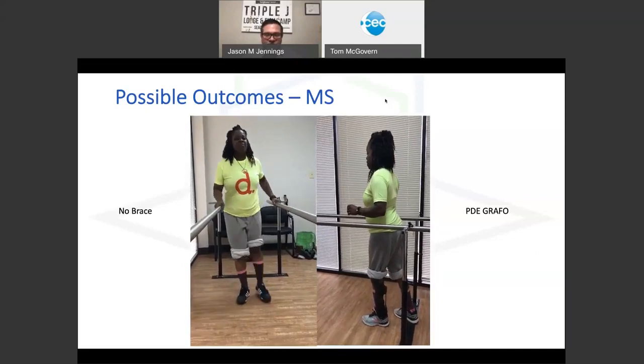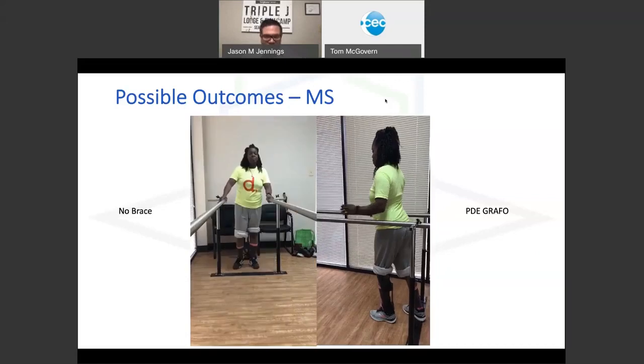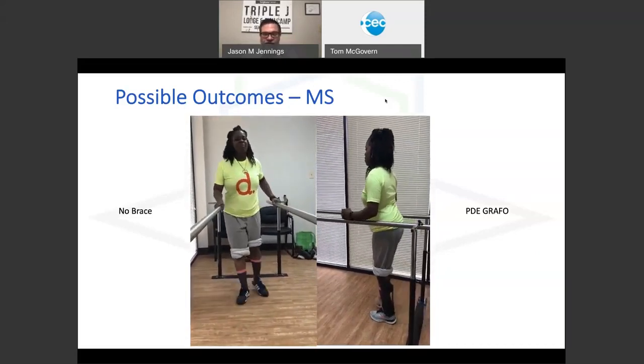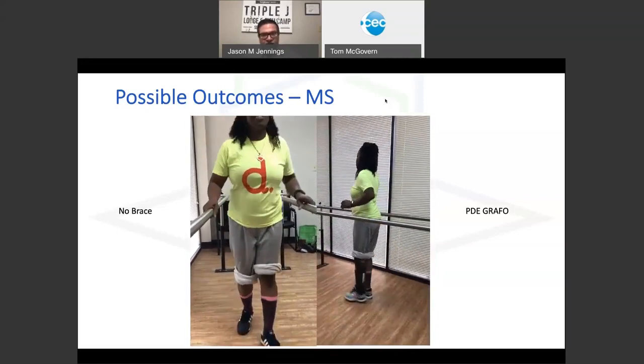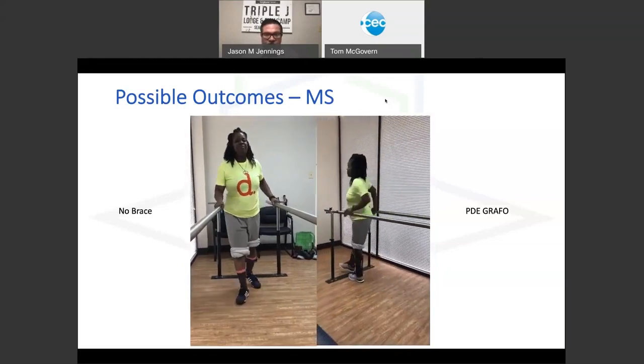And that's some of the things that your patients will experience when they start to deal with a brace that now is stable, that they can actually shift their weight over, is they're trying to figure out how can I stay stable while I actually shift my weight. And she really needs to go to PT. You got to remember this is just day one of the fitting.